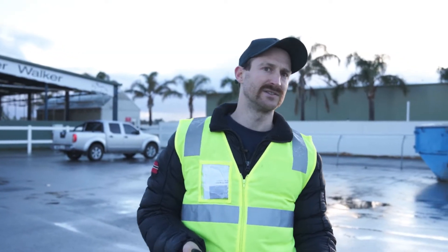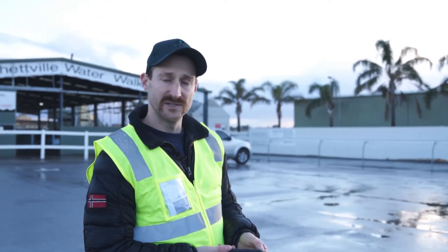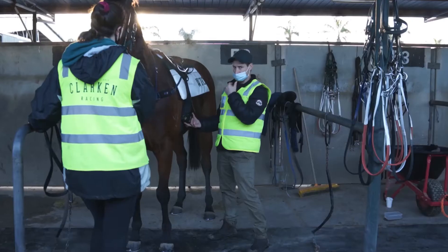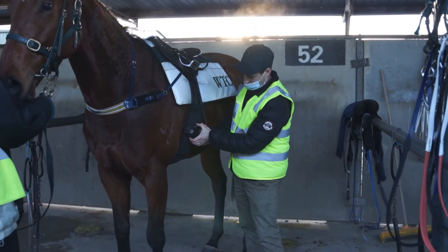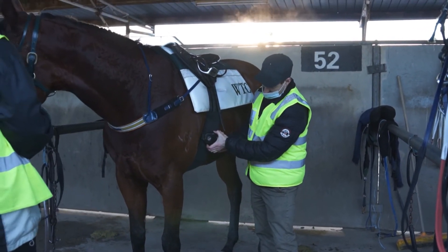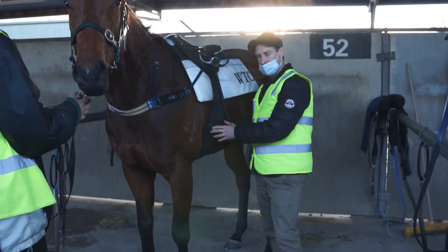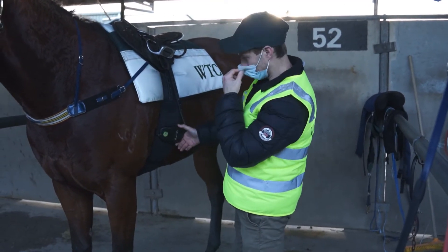If he were walking around still quite elevated, that would indicate that he's not as fit as we thought, but he's showing no signs of having taken any ill effect from that gallop. It's now time to remove Sidearm's tracker — we hold down this button to complete the session, it beeps to let you know the recording is completed, and then later we'll upload that to the computer and analyze the data.